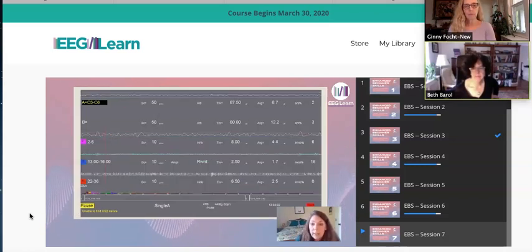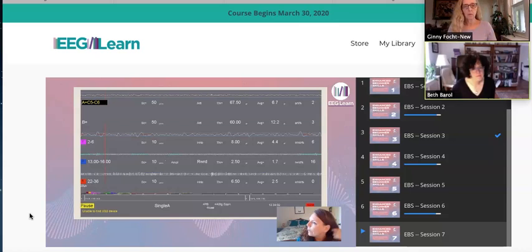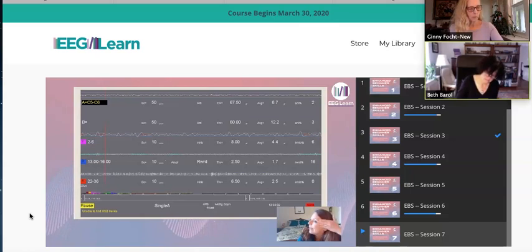Okay? Here's an example. This will come up very often when you're doing bipolar training, where all your numbers are really low. This is another left-right interhemispheric hookup, C5 minus C6. This one is really considered a great protocol for people who have true bipolar disorder. And I think we talked about this before, but just as a review, an easy way to find C5 and C6, you just go 4 fingers above the ear in line with the preauricular point. On the left side, that would be C5. On the right side, it would be C6.